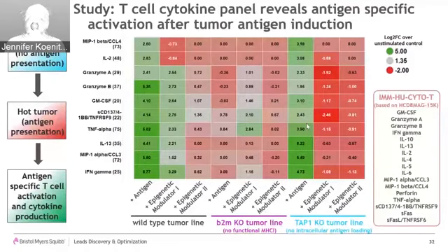In both cases, our epigenetic modulators don't work anymore due to the deficiencies in the antigen presentation pathway, which together with other data gave us confidence that the approach is promising. So this is an example where we use complex cellular models and routine profiling of T cell activation markers to better understand the mechanisms and validate targets in IO.